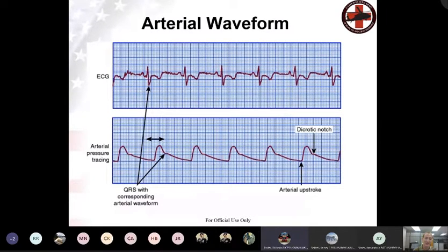So it's kind of like that in between the beating of the compressions of the heart. I feel like I'm just going in a circle here. That's okay. Captain Angelotti, can you help him out a little bit? Ma'am, my guess would be the repolarization. That seems to be correlating on the EKG with the dicrotic notch.